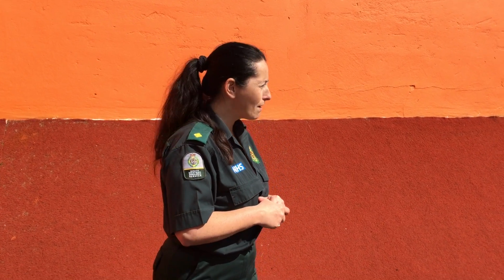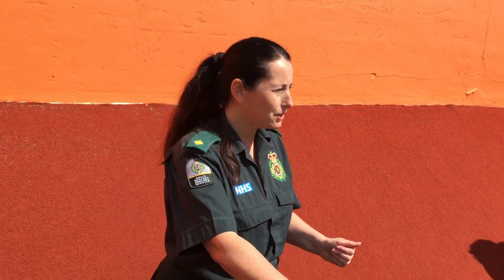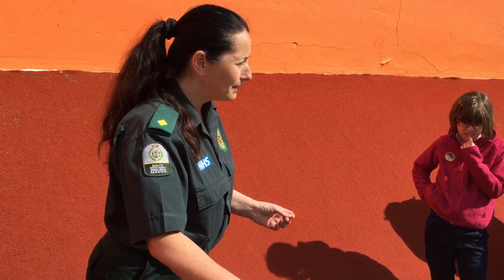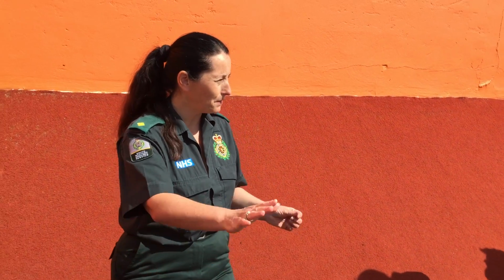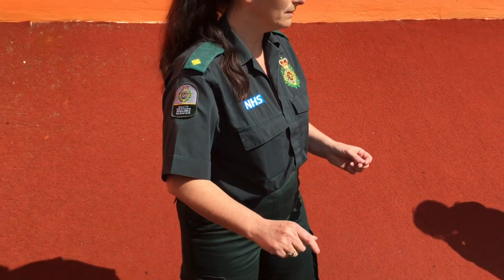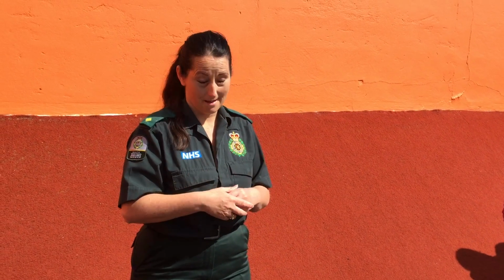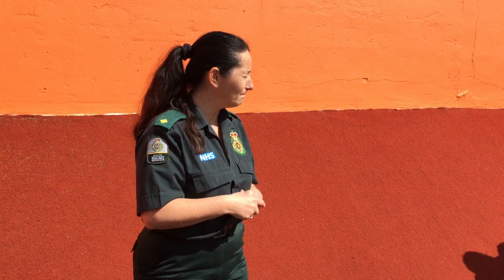What's there a few of stood around here? People. So when the machine's analysing, when it's shocking, please make sure everyone's clear. Like I said, when it's analysing, if someone touching the patient, it's going to pick up movement and is going to pick up your heart rhythm rather than the patient's. And secondly, if someone touches that patient while you're pressing that shock button, they can get the shock, which is obviously vitally important for the patient.